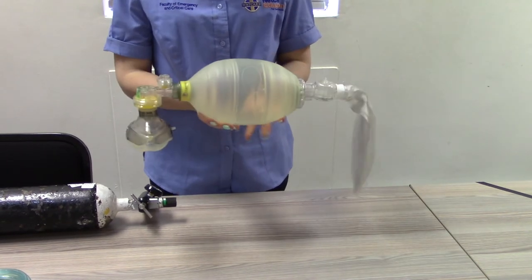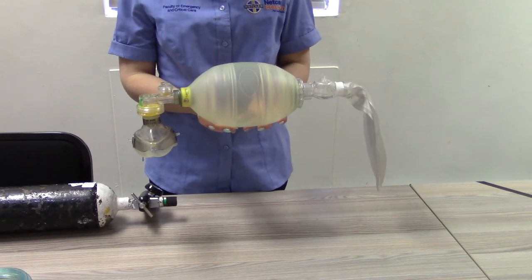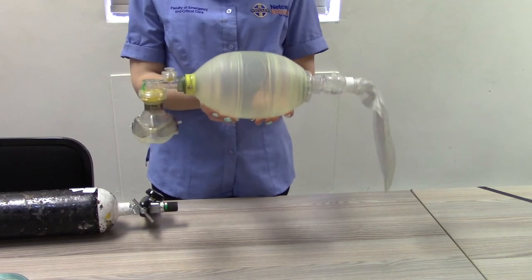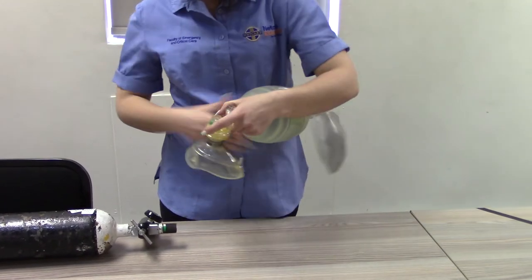Testing function of BVM. Compress the ventilation bag while listening for airflow at the patient connector, or feel the airflow against a hand placed in front of the patient connector.